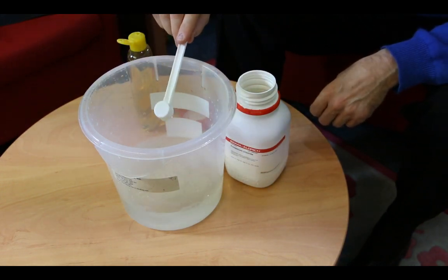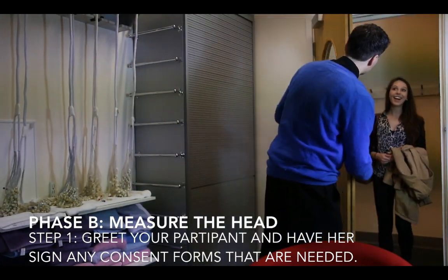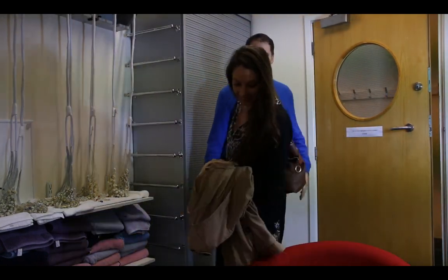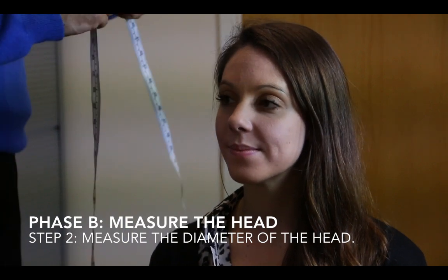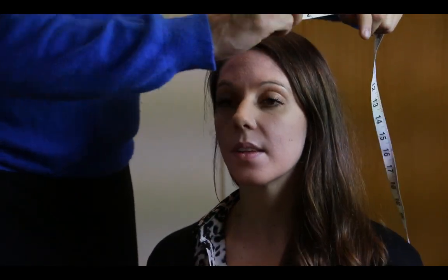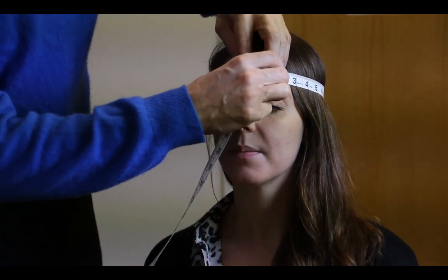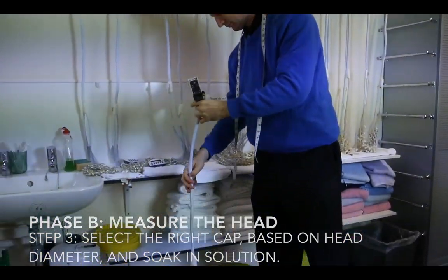The second phase involves taking various measurements of the participant's head. First, greet your participant, have them sign a consent form if needed, and explain what the experiment will be about. Next, measure the diameter of the participant's head to find the correct cap size. Cap sizes in our lab are measured in centimeters. Once you've selected the correct cap, soak it in the prepared solution and set a timer for 10 minutes.